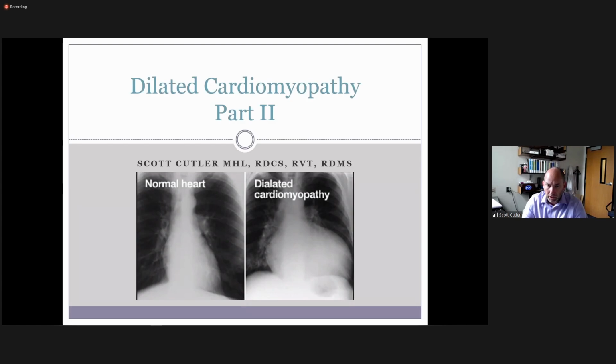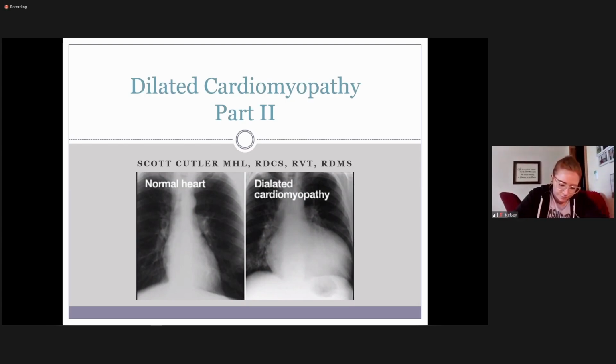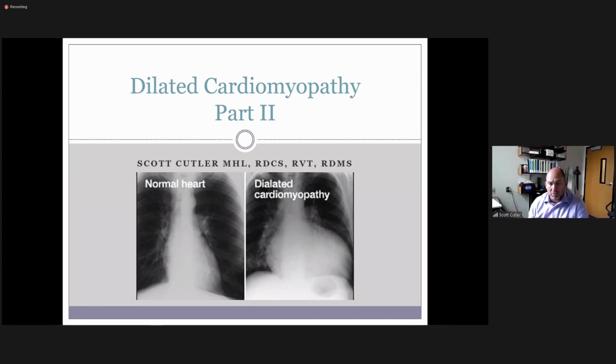Just like on an aorta, if we came across a stenotic valve, then you start tracing the aortic flow as well as the LVOT for the VTIs rather than just a peak velocity. Peak velocity is a quick way to get us where we need to be when we're not concerned about stenosis. It's just a screening type of thing. So that's an example of when you would boost your protocol and start doing a little bit more.